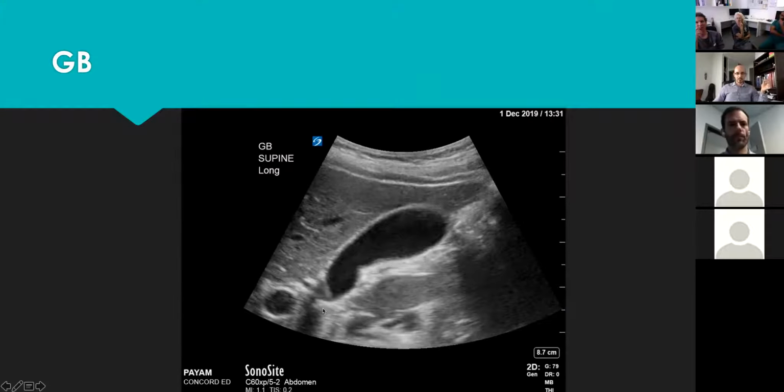And if you can see, there are a lot of hyperechoic areas, which would be mainly the duodenal gas. So it's very, very easy to miss a stone which is in the neck. That's the importance of then turning the patient into either an erect or sitting position, or a prone position, kneeling on the hands and the knees, so that we change the dependent part of the gallbladder into its fundus, so the stone falls into the fundus and we can see it, if it's not already stuck in the gallbladder neck.